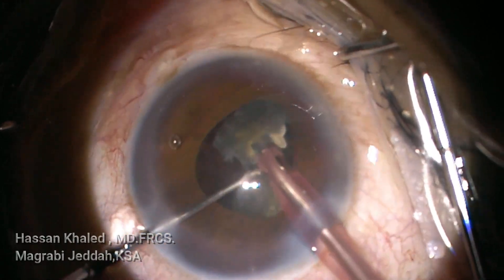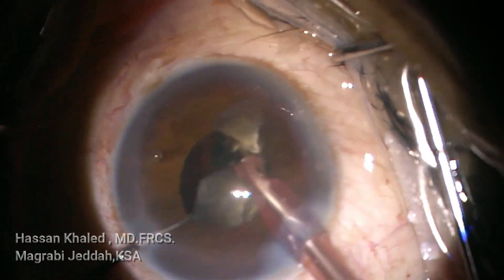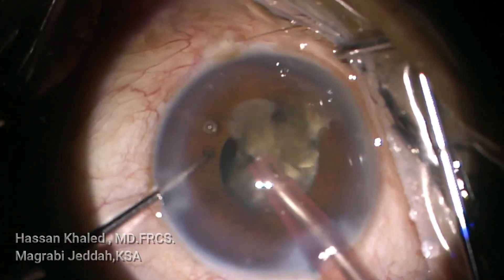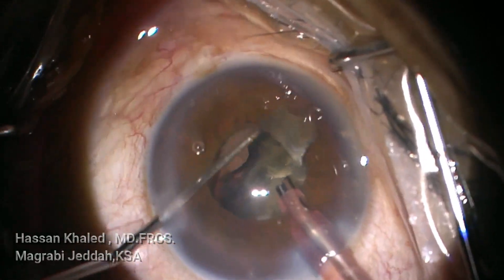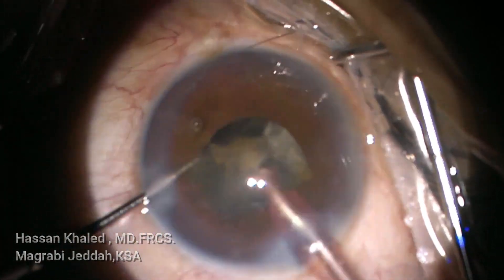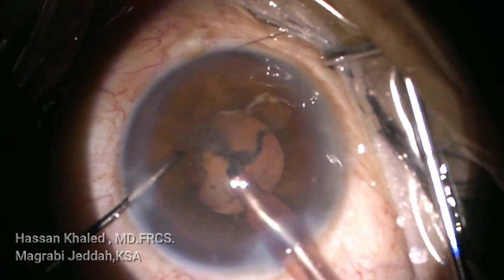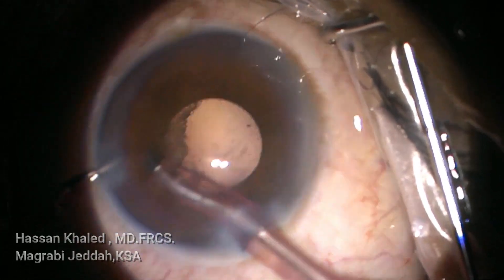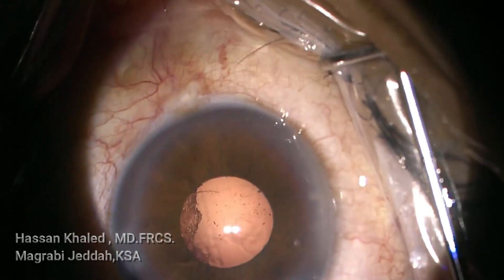Now you can see the emulsification of the last pieces. You can see the posterior plate of this dense cataract was not chopped very well. Now all the cataract — all the nucleus — has been emulsified.